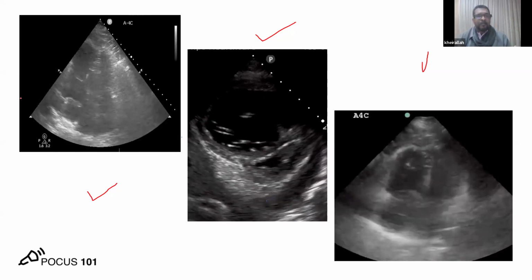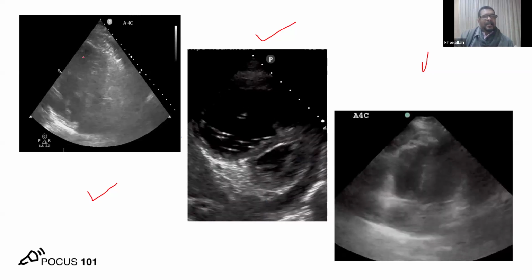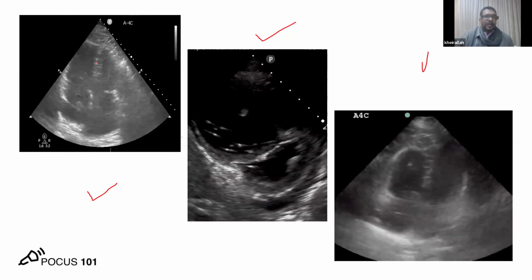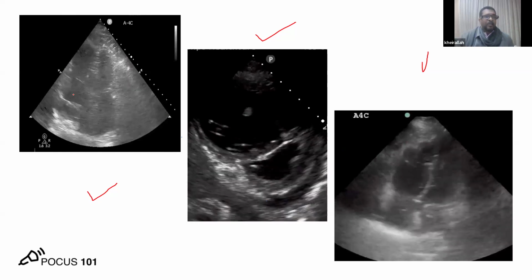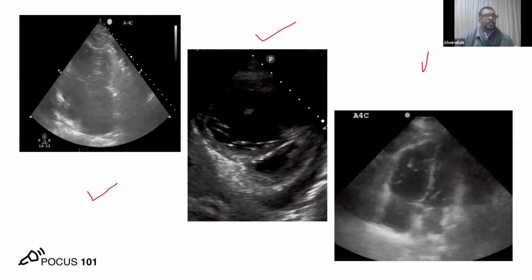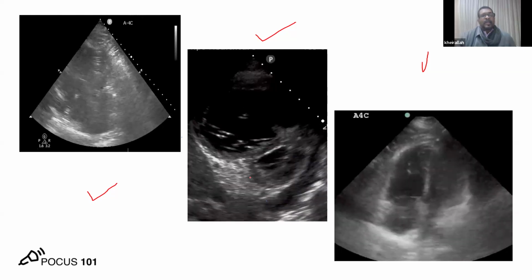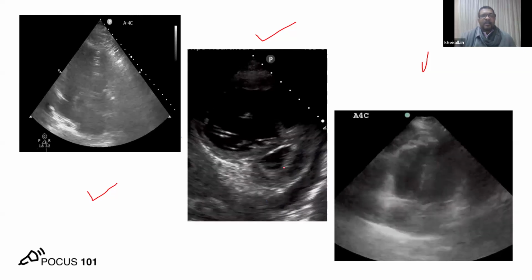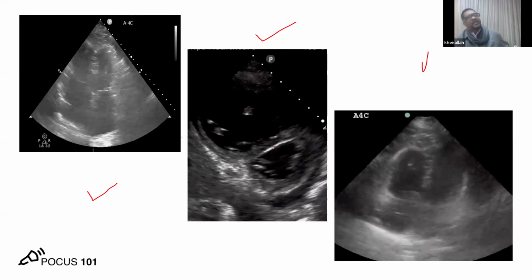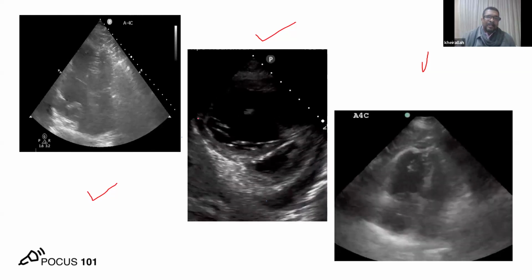And this patient in particular was a patient of pulmonary embolism. That's why he was seriously sick, and the image quality was depressed because of that. So we see the RV is dilated, and we see a mass here. A thrombus is looping into the right atrium. And you look here at the D sign, when the LV is compressed due to RV dilatation. Flat septum, D-shaped LV because of dilated RV.